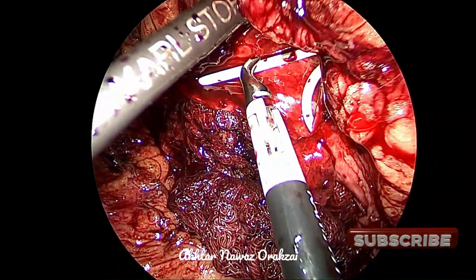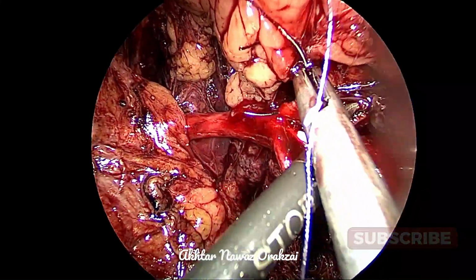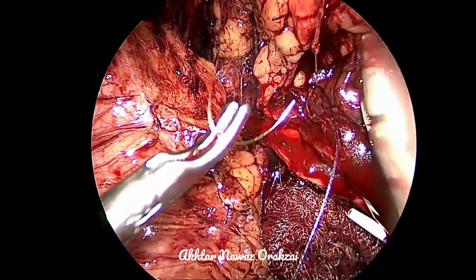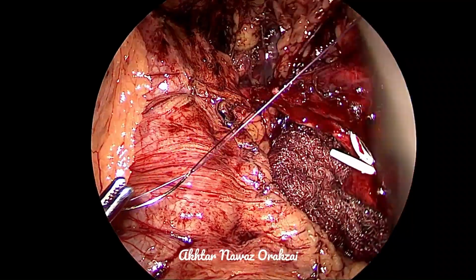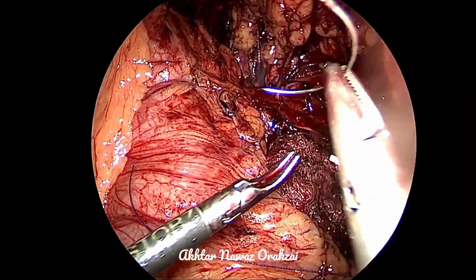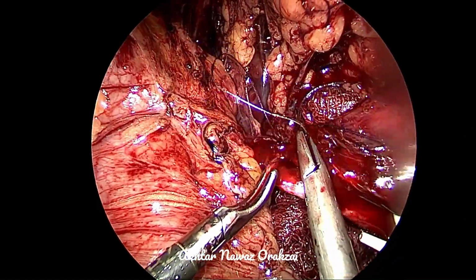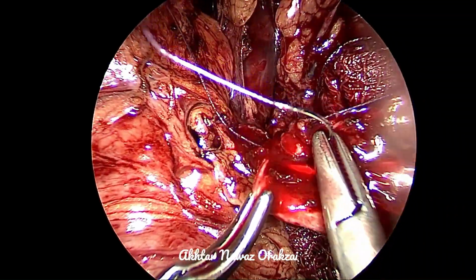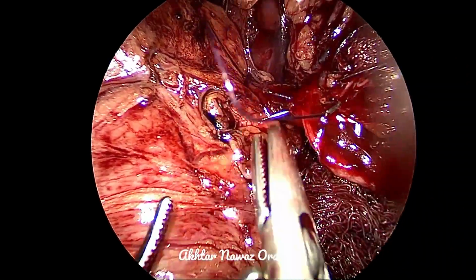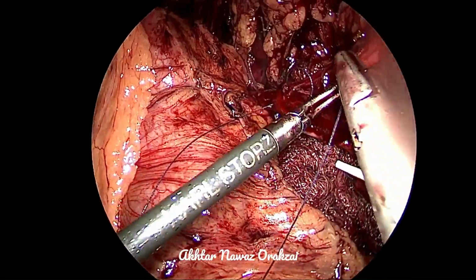At times it becomes really annoying, but you have to push it really well into the pelvis. So then the anastomosis of the anterior wall is started with the stitch in the corner. Corner needs to be cleaned. Here we have seen the DJ stent. So it is a nice strong stitch taken into the corner of the anastomosis.